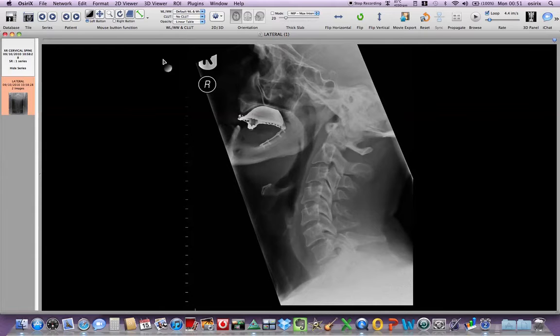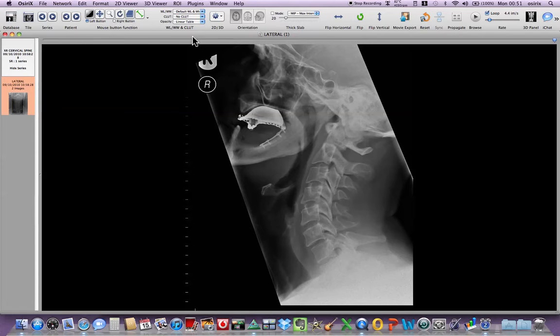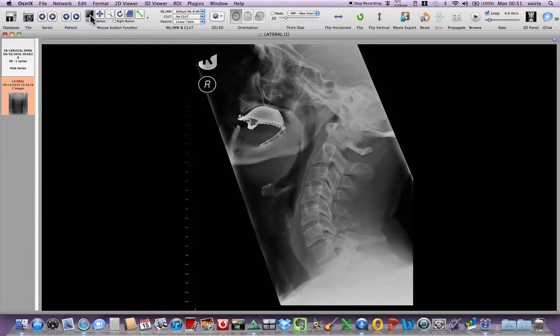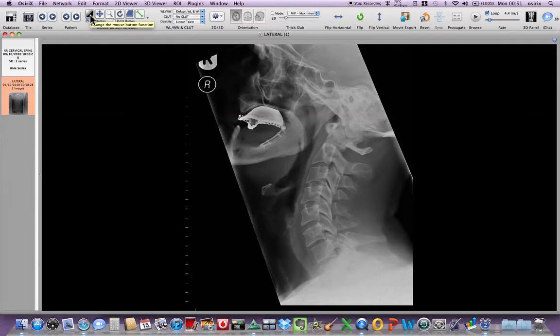There are lots of buttons on the top row, the most important of which I will show you now. The window level is used for CT, MR and plain films. For plain films it is effectively a contrast and brightness button.